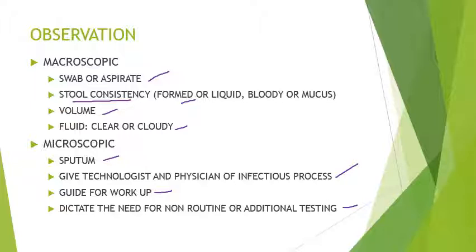But for the urine specimen, it's not routinely done, but it's actually good if you're a good medical technologist, you can assess the urine specimen microscopically. Baka kasi mamaya may mga bacteria or sobrang dami ng bacteria. Then, it is a way to assess kung baka mamaya may UTI na talaga. Okay? Pero it's not routinely done because urine sample is analyzed in 24 hours. So, after 24 hours, makakakuha na kayo ng resulta for urine culture.